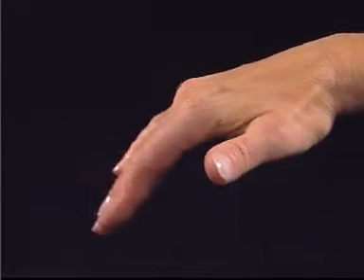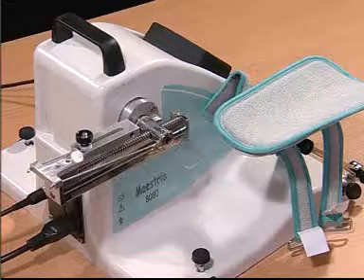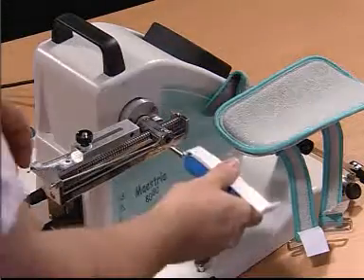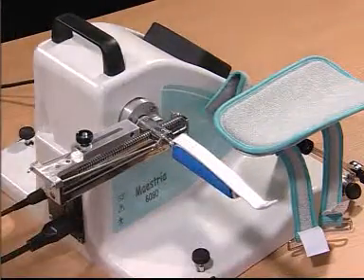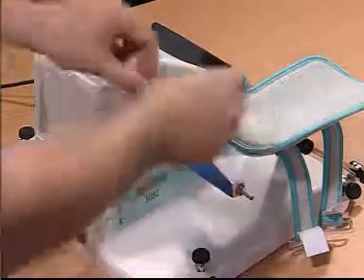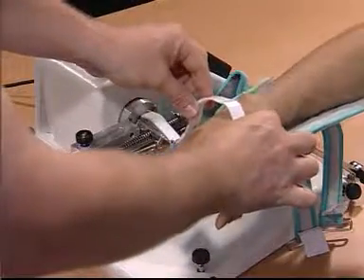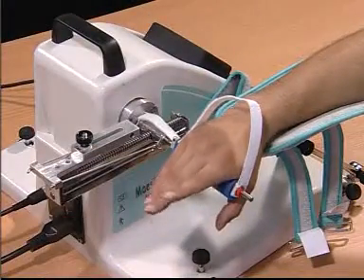This movement is for MP flexion or intrinsic plus. We again use the trainer with the polymer support, which is a pivoting bar with a blue foam pad.